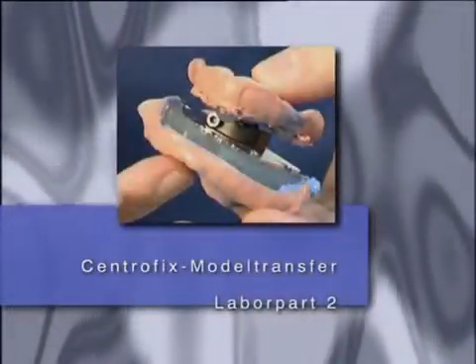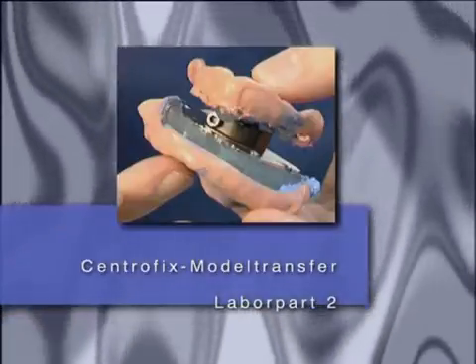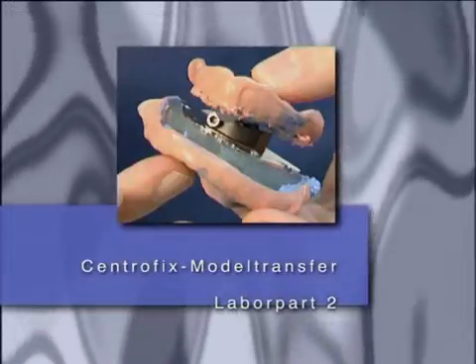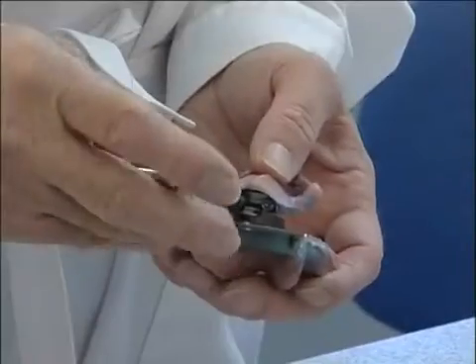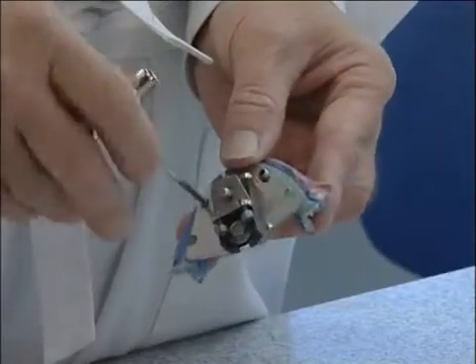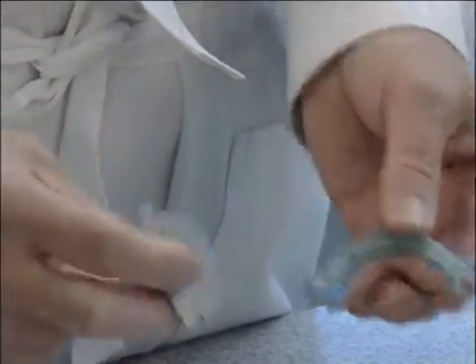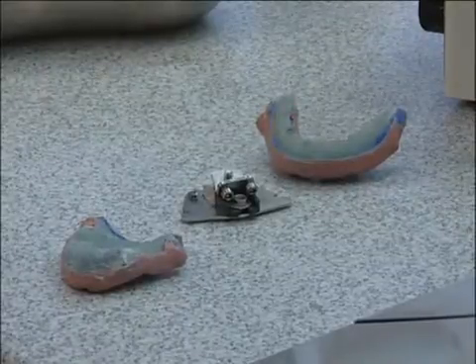The outcome of the functional impression procedure, that is, the upper and lower impression trays fixed together with a centrofix, is sent to the laboratory. The precise jaw relationship is maintained as the tracing ball is tightened in the alignment clamp. Both trays must be detached from the centrofix registration instruments for casting the models. First, unwind the 2 Allen screws from the pin holder and remove the upper tray. Then, loosen the 2 grub screws in the tracing plate and remove it from the lower tray. The jaw relationship is retained as the tracing plate and ball are connected.